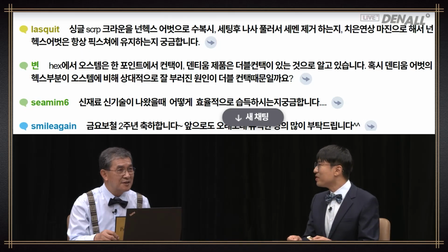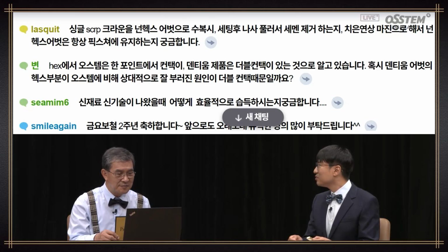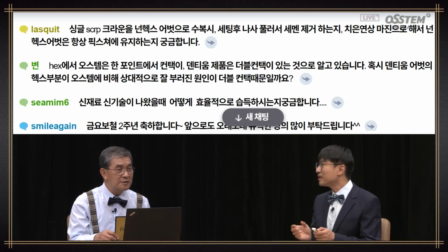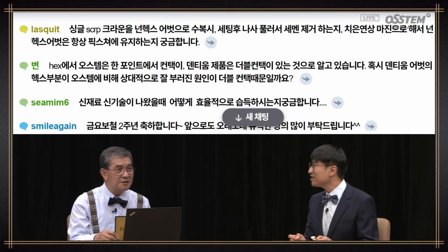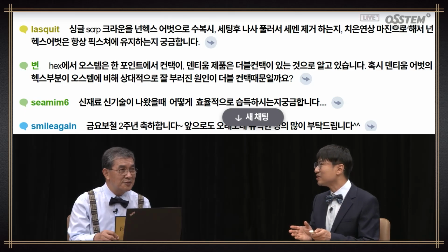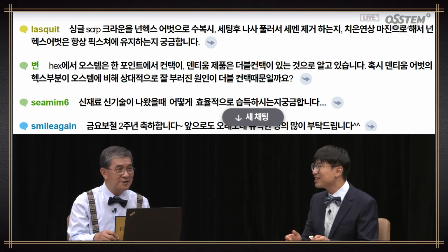To give you a straight answer, if possible, I don't remove excess cement extraorally. I try to do supragingival margin, non-hex abutment single restoration. Repositioning it is very difficult. You can put it in similar position, but it's difficult to do it in exactly the same position. As you do it, occlusion or contact can change. I can position it in a position where a lot of clinicians can relate to because I have a lot of experience using non-hex, but this is not a general case.